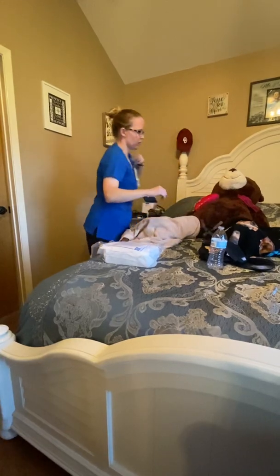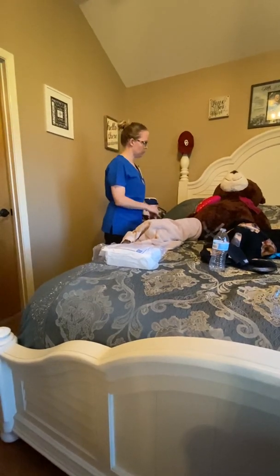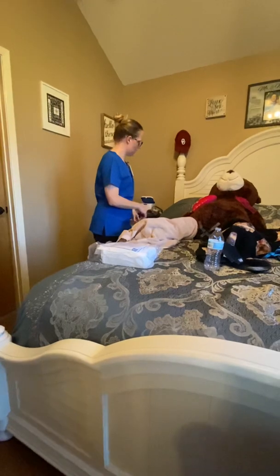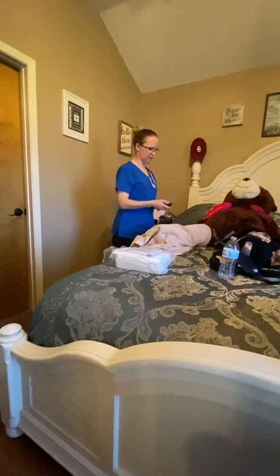Okay, so we're going to make sure that we are in a good working position, so we'll raise the bed, and then we'll make sure that the bed rail is put down. Then we're going to put the patient into a supine position. This is for both males and females.